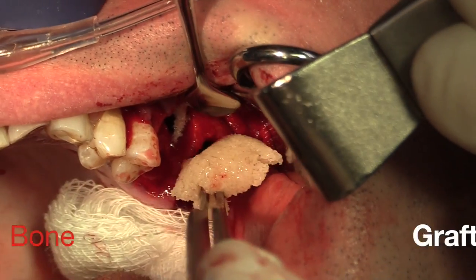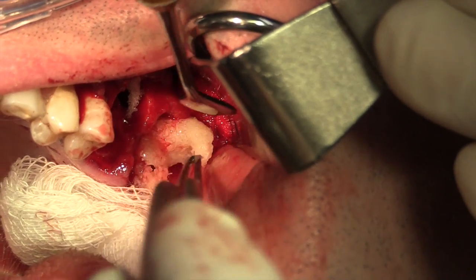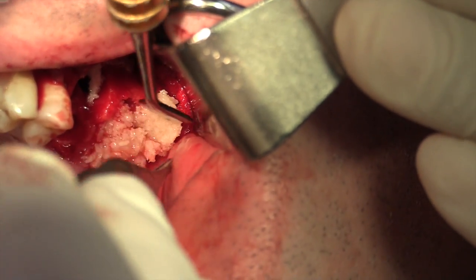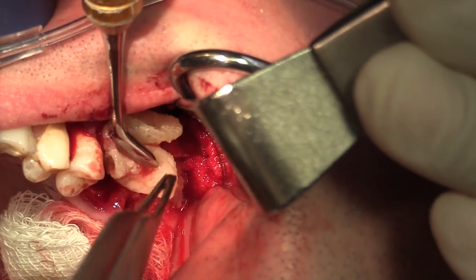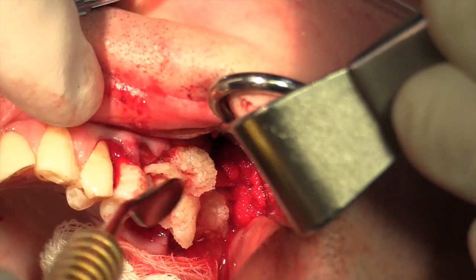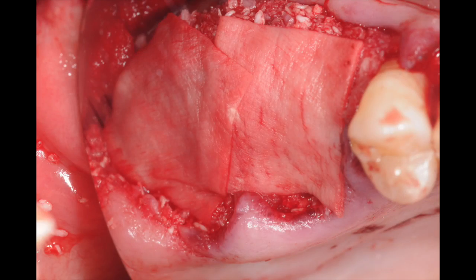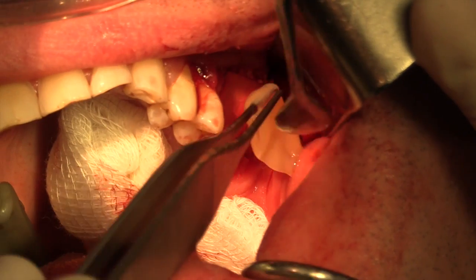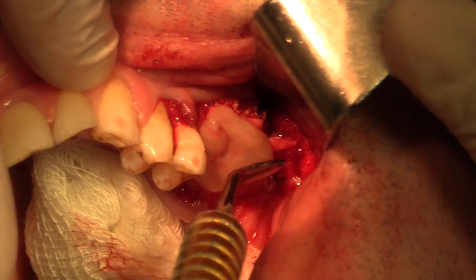For bone grafting, we have already prepared a PRGF and mineralized freeze-dried bone complex, which we'll pack into the site until completely filled. A somewhat firm pressure is placed on the bone to assure proper placement and density of the bone graft material in all areas of the defect. We'll then cover the bone with a resorbable collagen membrane and then cover that with our PRGF membrane as an occlusive dressing.